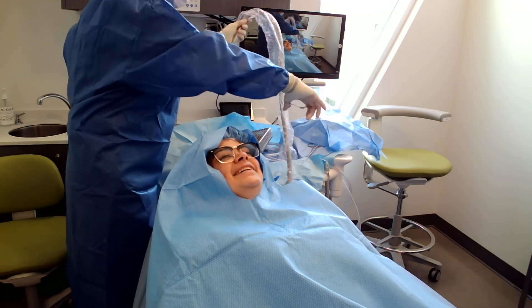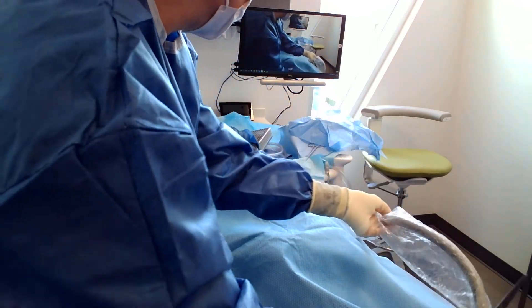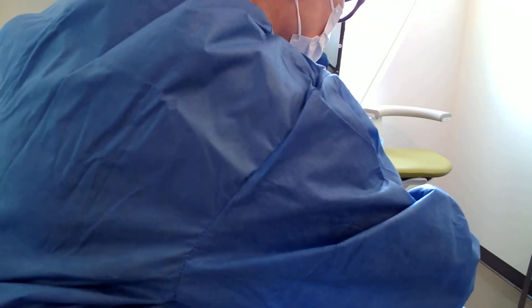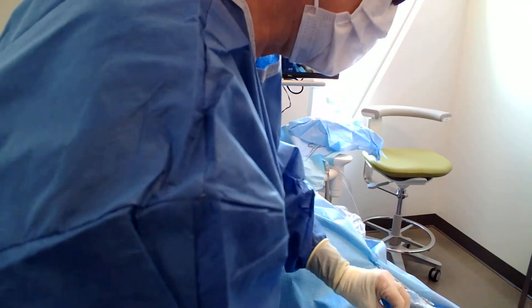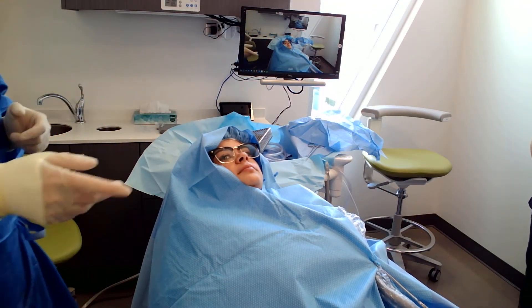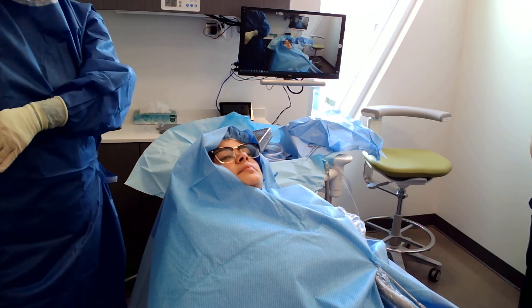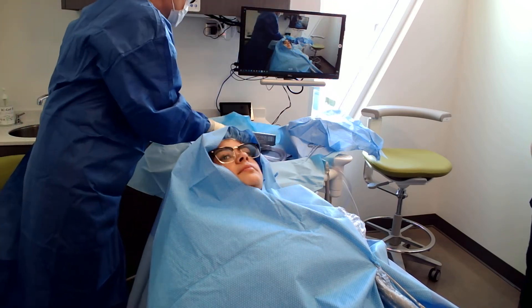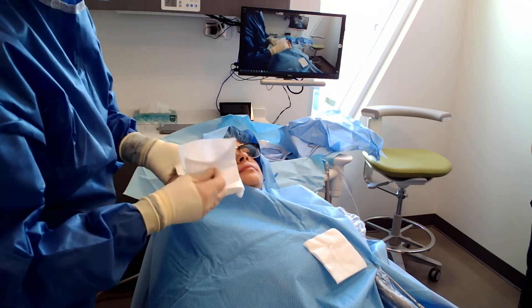I'm going to put my suction — Courtney, is it okay if I just put a couple of items on your drape? I'm going to clip the suction to my drape so it's right there and I don't have to reach for it. If we had the implant handpiece here today, it would be behind where the surgeon is and would come this way, and I'd clip it back to the drape as well.